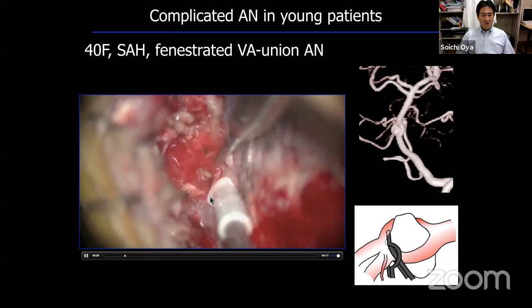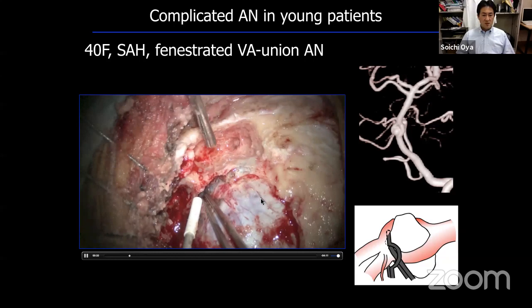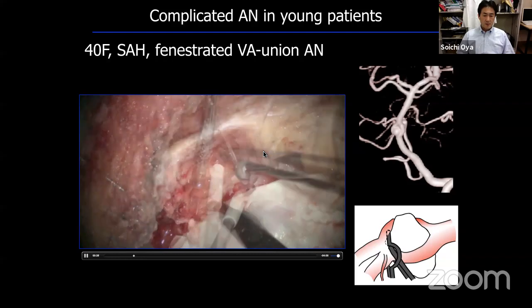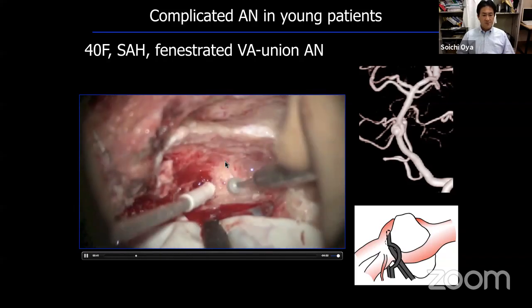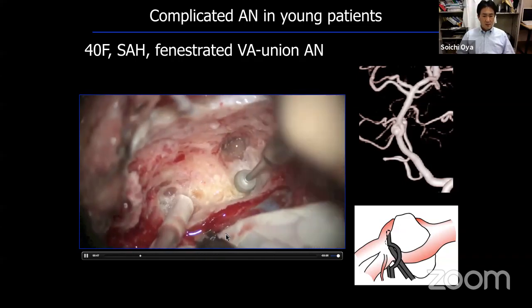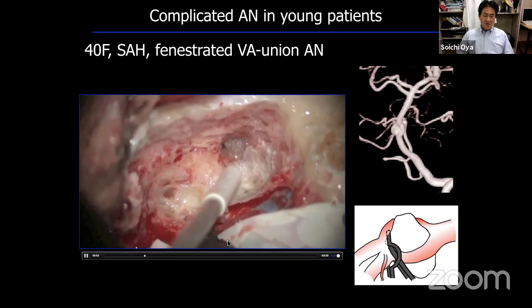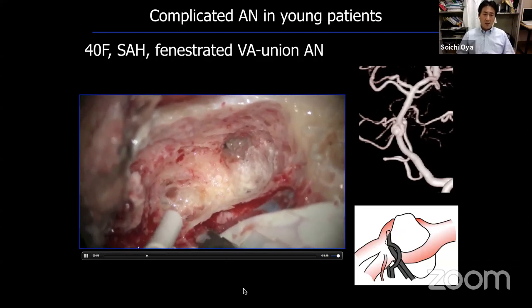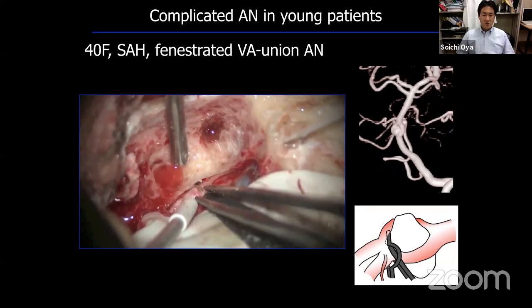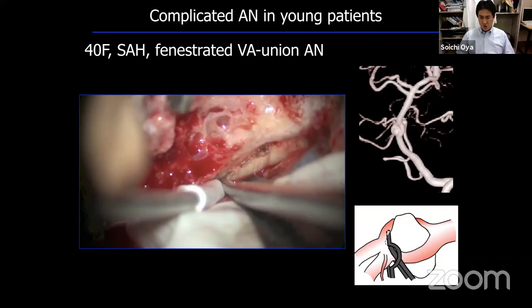After this part is done, I moved to the transpetrosal approach part. This is the antrum and the lateral semicircular canal here. Let me emphasize that for vascular surgery, I think aggressive drilling is important because you may need a little bit more wider space to accommodate the clip or temporary clip or larger suction tube.